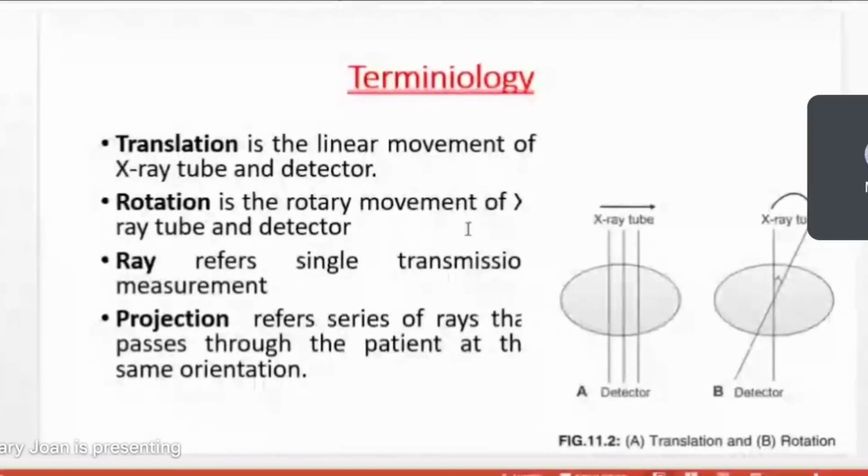These two are combined together to form X-ray images, and then further thoughts were put forward to use it to get more information about the inside of the human body. So that is what, along with the time required for completing the whole procedure of the CT scan, led to the major changes in the generations.